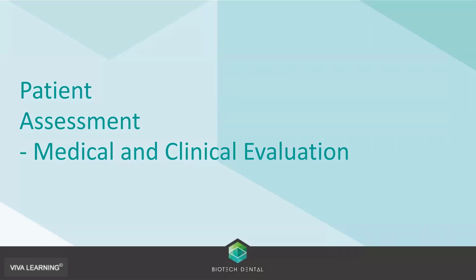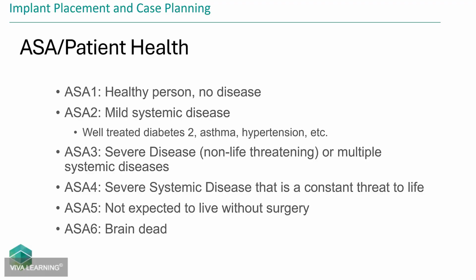So real quickly here, and again, we don't need to go over this in super, super detail because I know I'm getting a little bit long on the initial. The analyzing the patient from the beginning is important, but it's not something I think about as much as you would think. There's ASA's categories. You need to do implants on people ASA 2 and 1. 3 is not very often do I do 3.